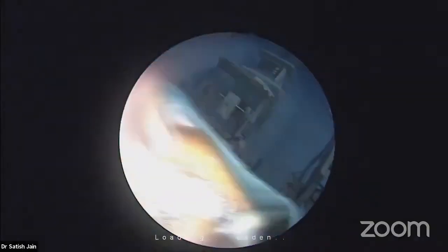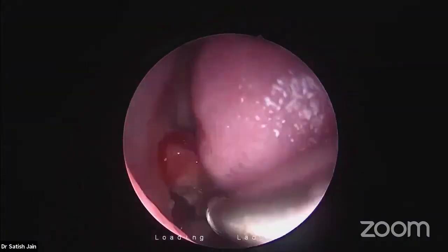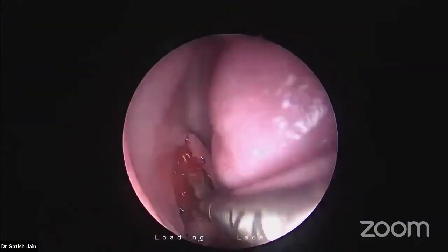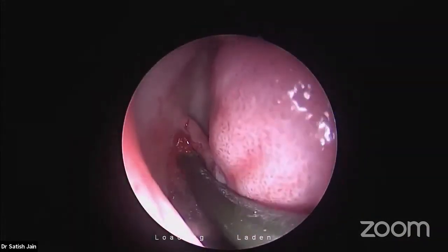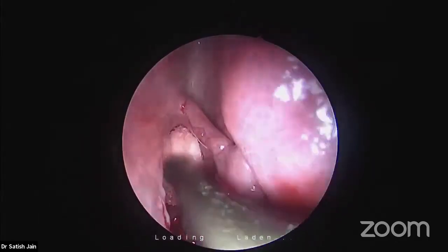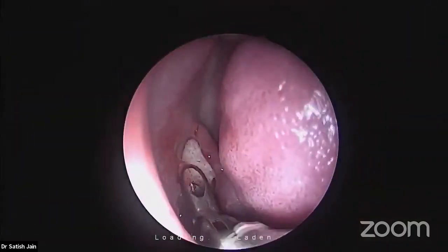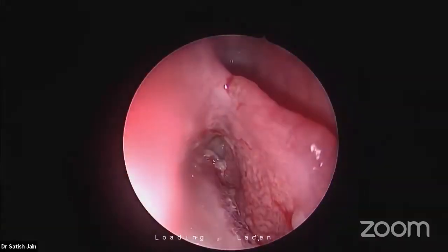Give me a small merocel to show you clearly. Let me show it clearly. Anybody has any doubt in the frontal sinus, let me tell you the simplest way to carry out the frontal sinus work in the most difficult situation. Don't get confused. The frontal sinus is not difficult. All you need to have is a 70 degree and certain landmarks in orientation. Simplest landmark here is the beak. I showed you on CT scan the floor of the frontal sinus formed by the beak. See the beak.